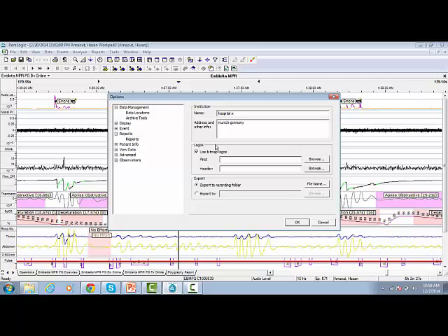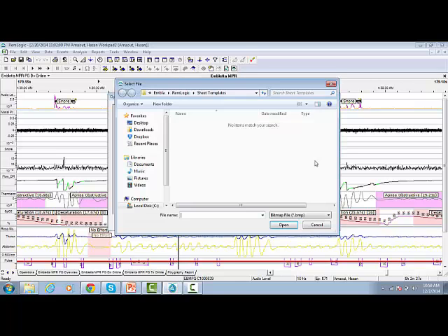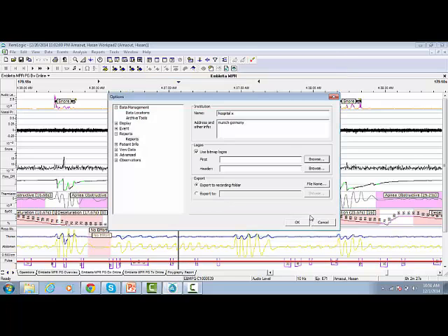For the logos, select Use Bitmap Logos. If a logo should display in the active reports, type the path for the logo in the first page text box, or click Browse to search for it on the computer. The logo displays on the first page of the active reports.